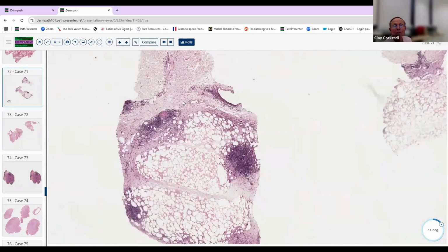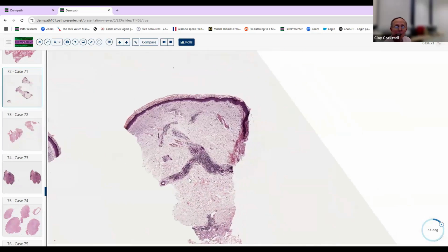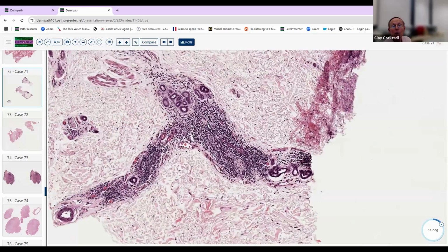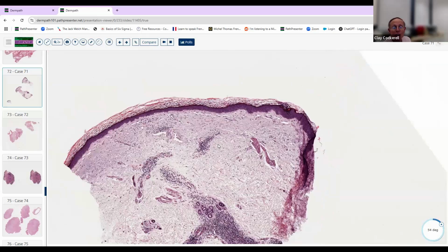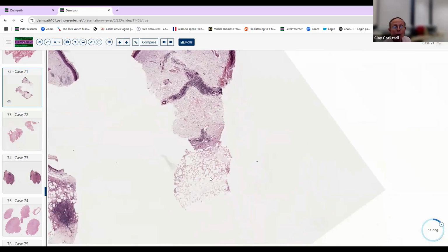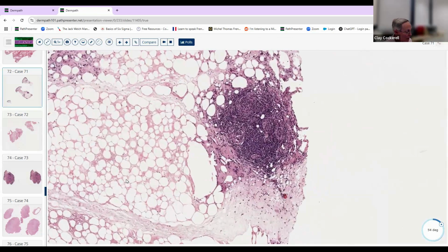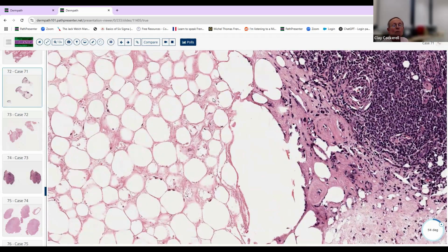And I don't think this usually has too much difficulty in distinguishing this from subcutaneous panniculitis-like T-cell lymphoma. You've got a little bit of lymphocytic infiltrate left up in the dermis. Sometimes you get a little bit of DLE up at the top. We don't see that here. This is a beautiful example of lupus panniculitis. None of the other diagnoses should have caused confusion. So we're going to pick up this hyaline fat necrosis, very, very characteristic.